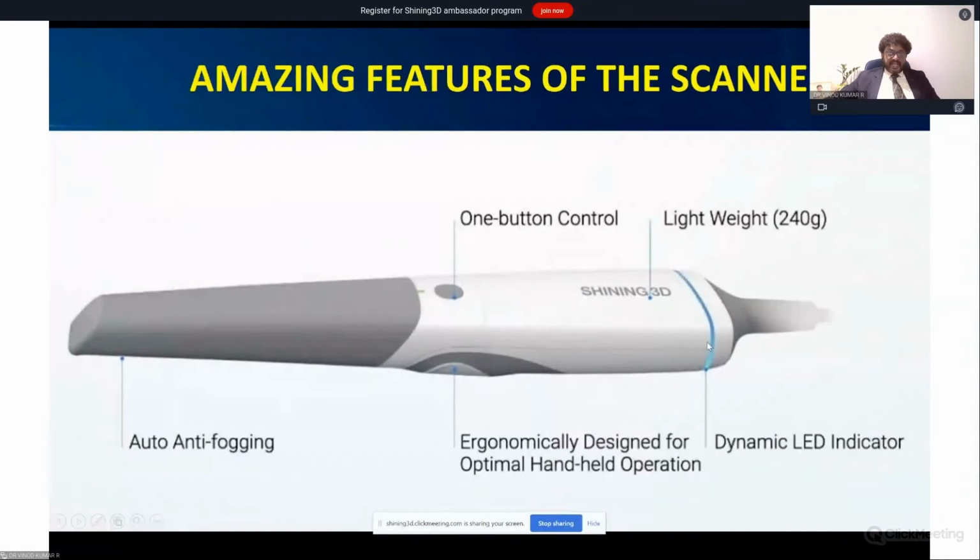See, when I pick up a scanner, the scanner works on a mirror. So there is a fan sitting inside which cools, and also there is a heating element inside which clears the fogging from the scan. If you have seen my scans, there are no dull surfaces on the scan. That's because there is a constant heating tip, and there is a very silent fan built within this.